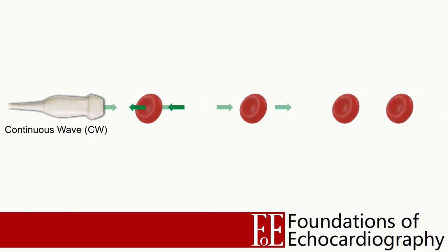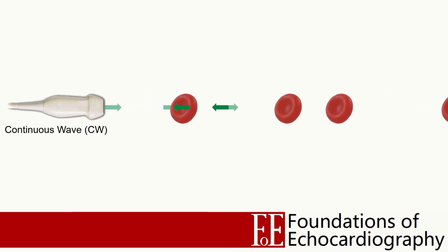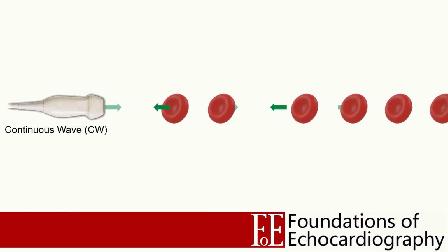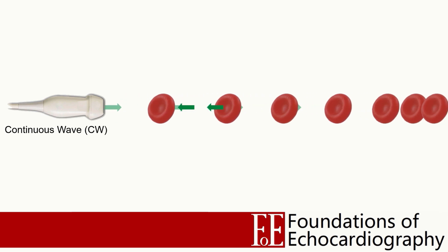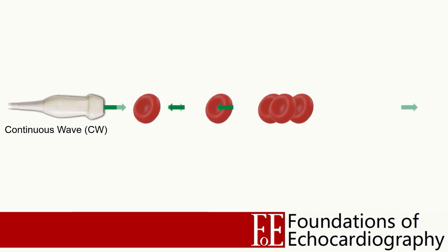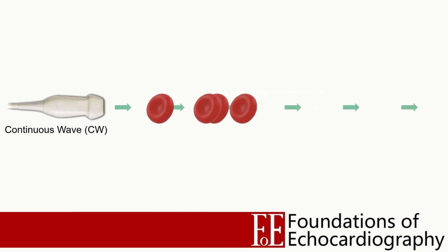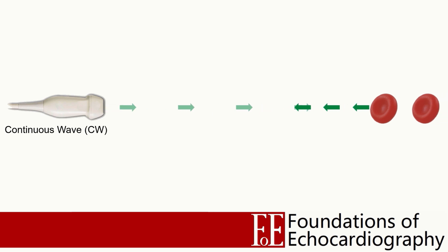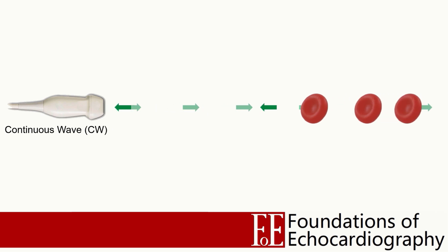Contrast this with continuous wave Doppler. In this technique, there are crystals that are dedicated to wave generation continuously, and there are other crystals dedicated to continuously listening. A returning signal may be a reflection from a superficial structure that was struck by a wave that has only just been generated, or conversely, the signal may be from a deep structure that is reflecting a wave that was generated relatively long ago.